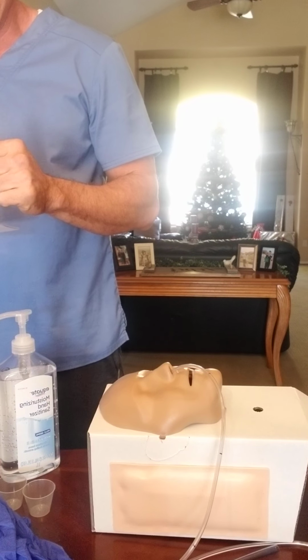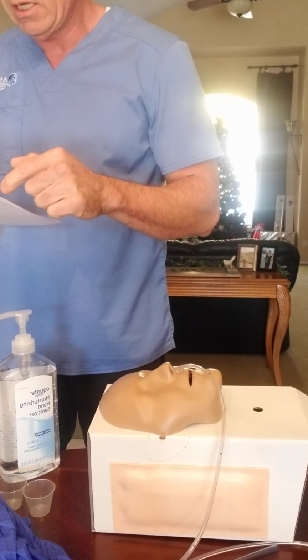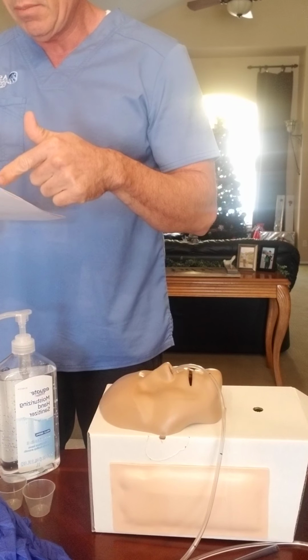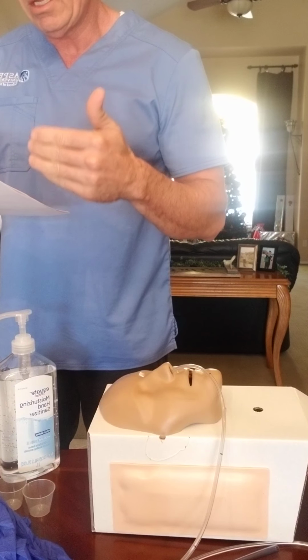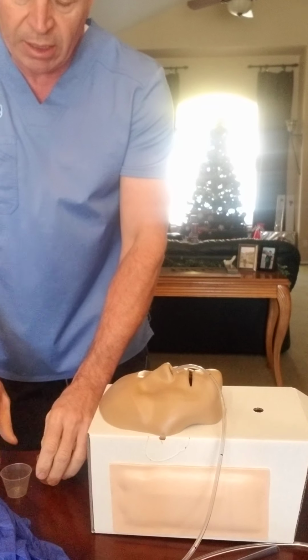Patient has an NG tube. He's not able to take any oral medications at this time, due to trauma, and the medications make sense for what his condition is. So I'm going to go grab the medications and the supplies. Make sure medications are non-expired.